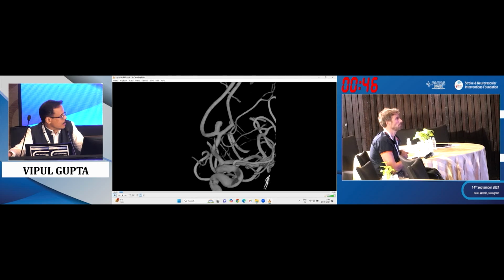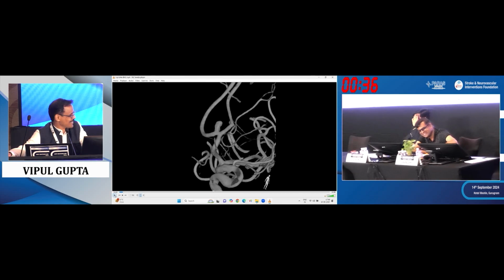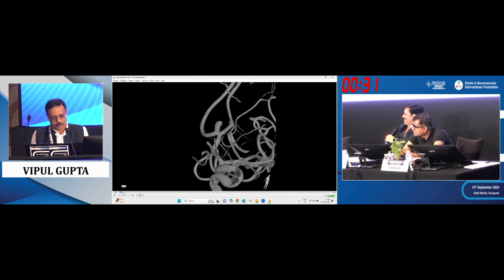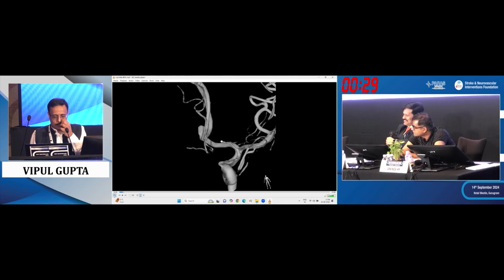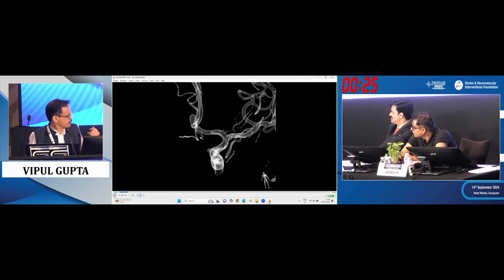And Ajay, coiling. Balloon assisted. Yeah. In fact, as soon as this picture came in, Ajay was like, okay, simple. Done. So, nothing complex about this case, just maybe we want to show some simple things. Balloon placement. You'll use a balloon or not?